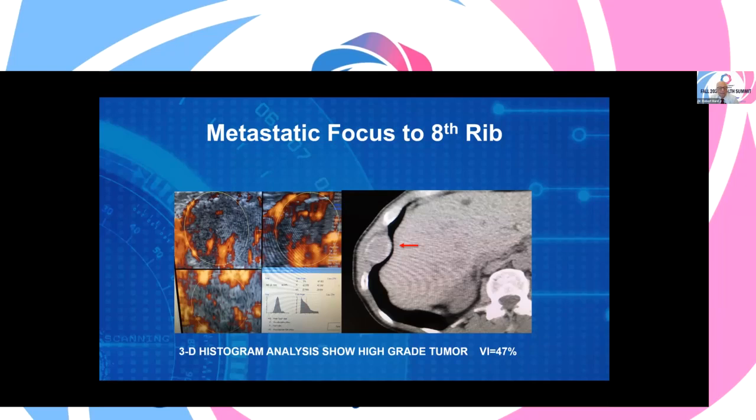Unfortunately, this fellow had pain in the rib. He was worried about having a rib fracture since he was a sailor. But while ultrasound doesn't penetrate through bone, when the bone is diseased and turned into permeable tissue, the ultrasound will go through. This way we look at the metastatic focus and we say, first, it isn't a fracture.